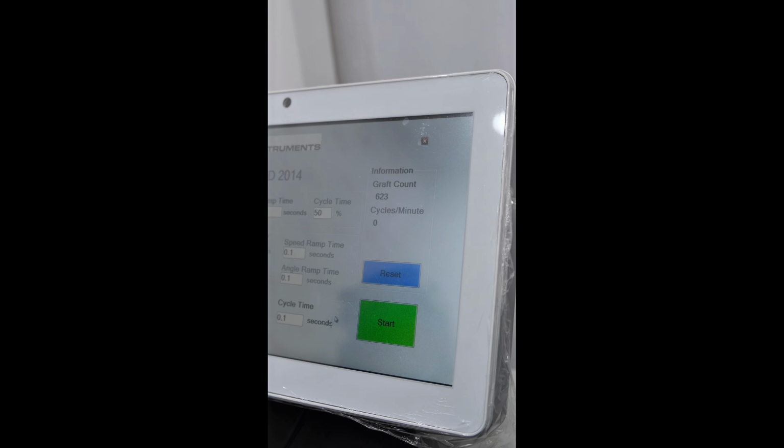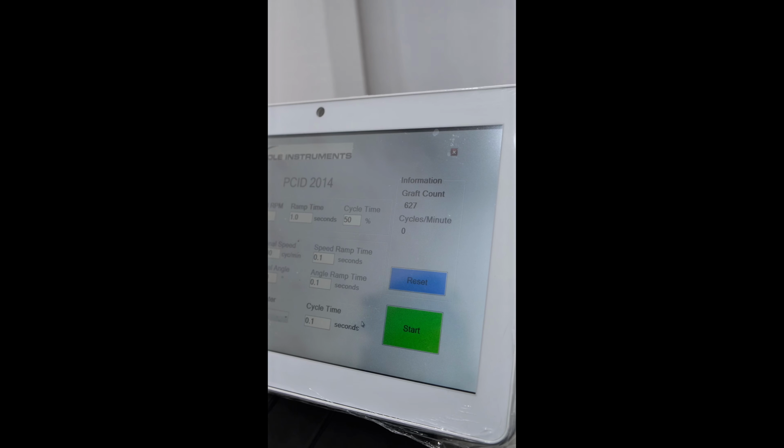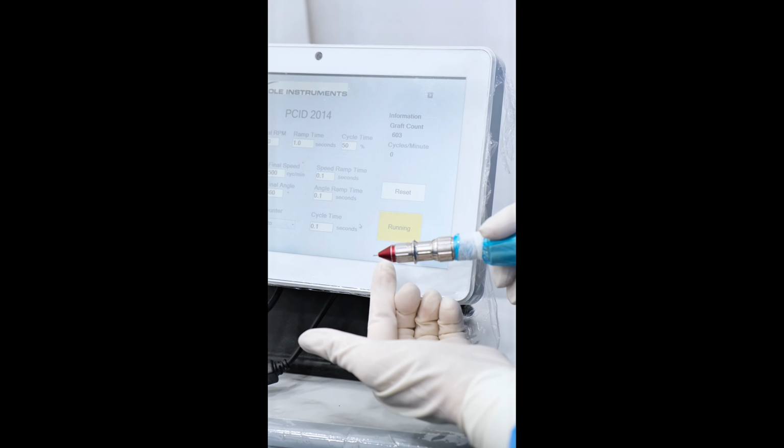Another sample, look here, it will change from the green to the yellow color, and the number will increase here. At the same time, my foot pedaling can be done continuously or individually, depending on how experienced the doctor is. This is moving, and that's it.